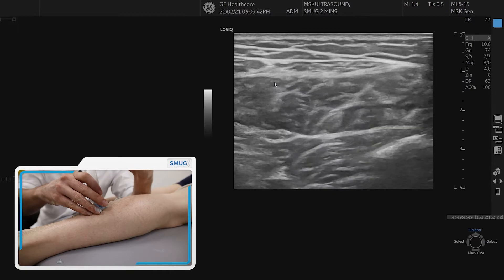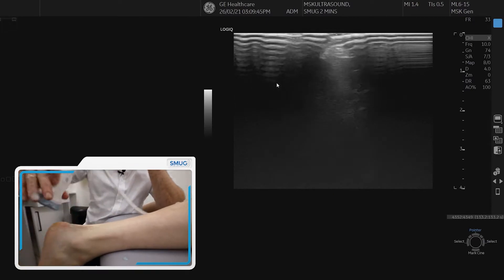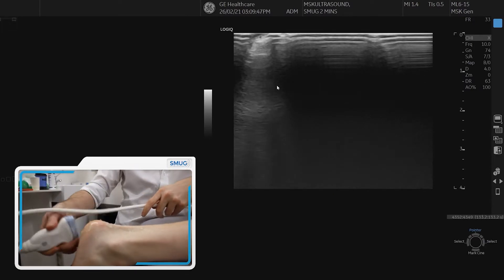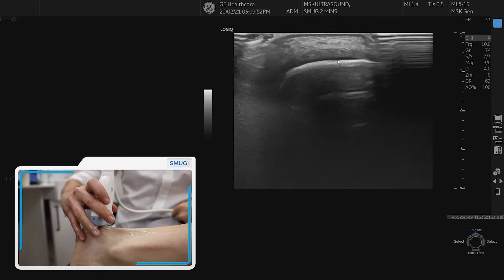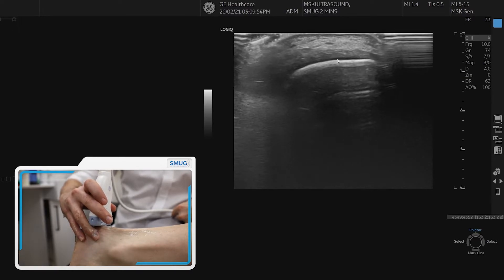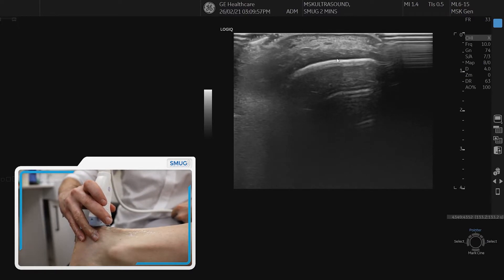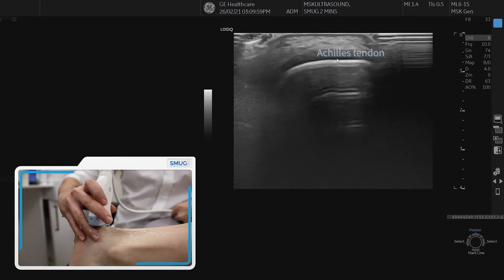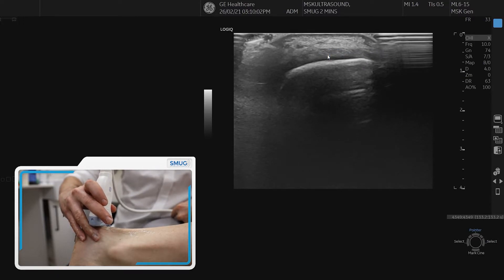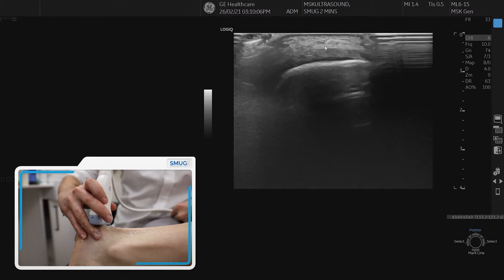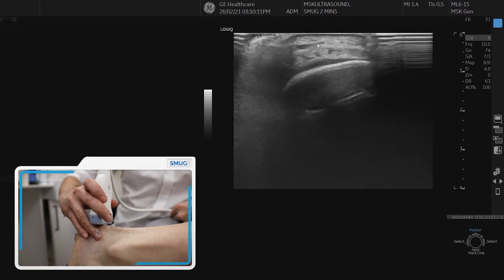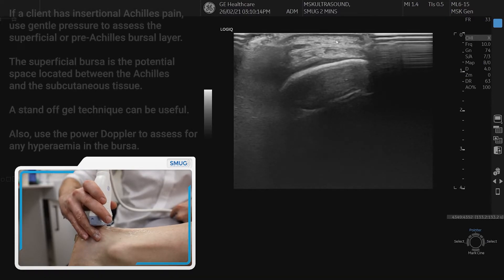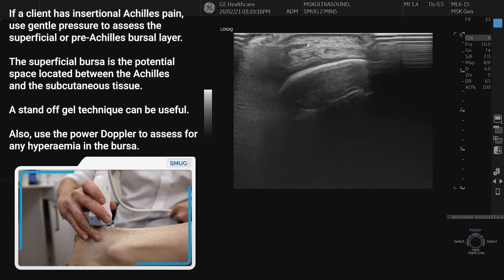Now we start back at the Achilles insertion into the calcaneum and do the same assessment in transverse. Coming off the calcaneum, in the superficial region we can see the start of the Achilles tendon. At this point it's important to be aware of the superficial bursa or pre-Achilles bursa — gently compressing reveals a region that compresses, and standoff can be used to assess this potential space.